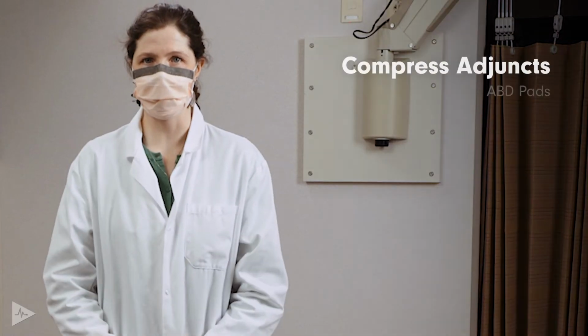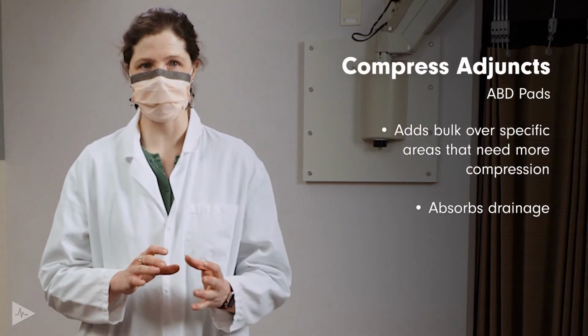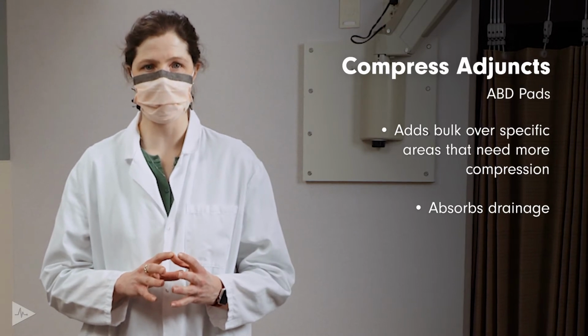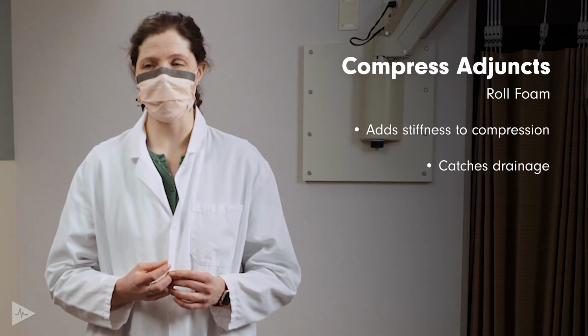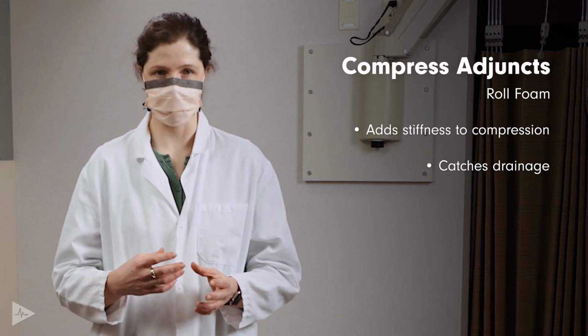We can use additional adjuncts to increase compression, such as strategic placement of ABD pads to add bulk over areas of wounds or fibrosis. We can use foam for protection and increasing the stiffness of compression. And you can also use cotton batting for additional protection from the compression.